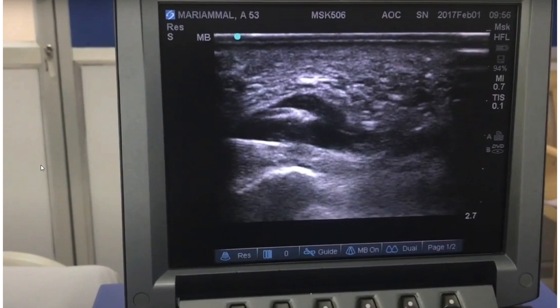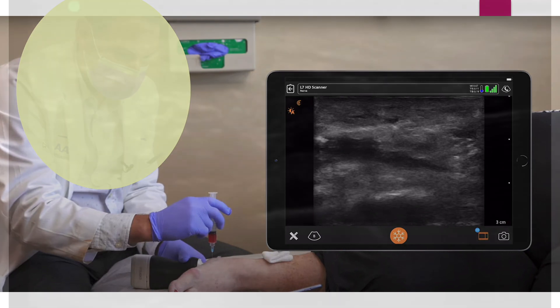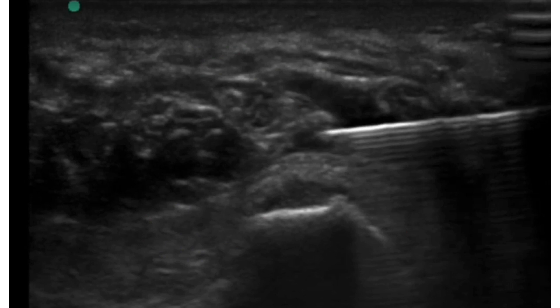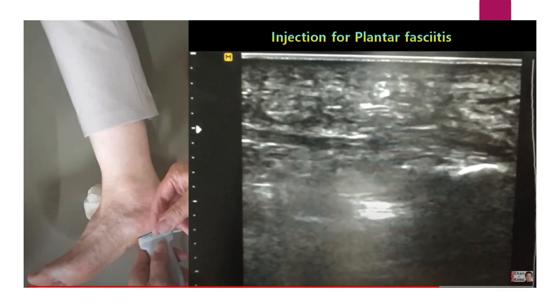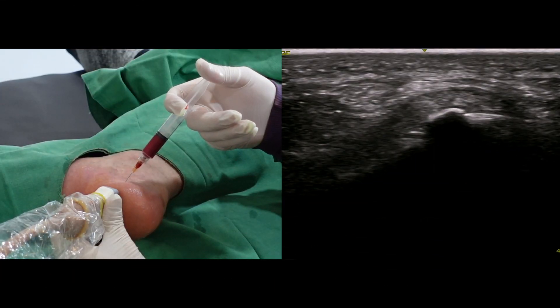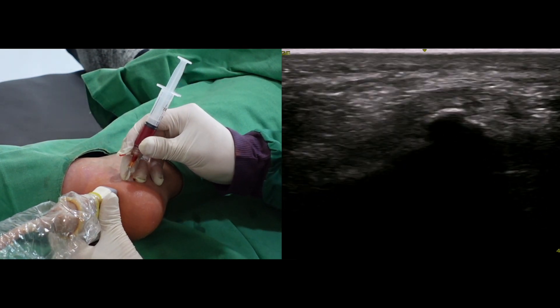Where is your injection target? While researching plantar fascia injection, I found two different injection types. The first is the superficial injection to the plantar fascia. The second is injection under the fascia. My needle tip is located on the surface of the plantar fascia insertion area.